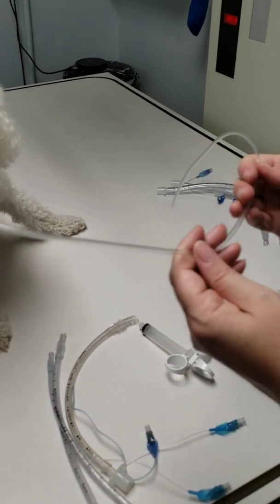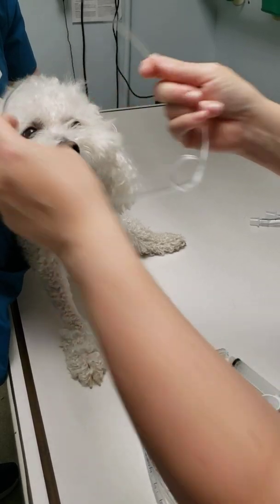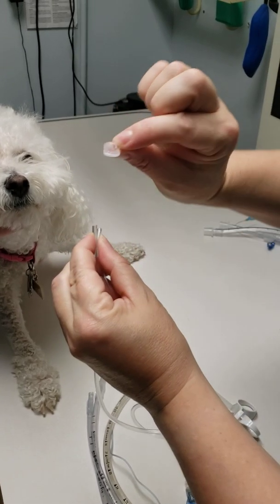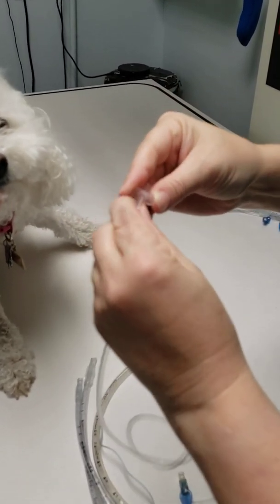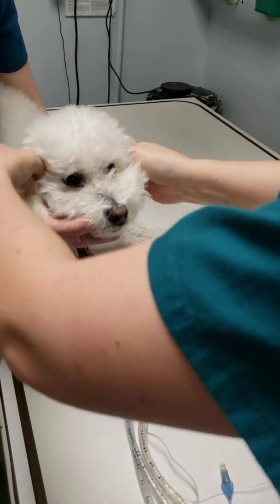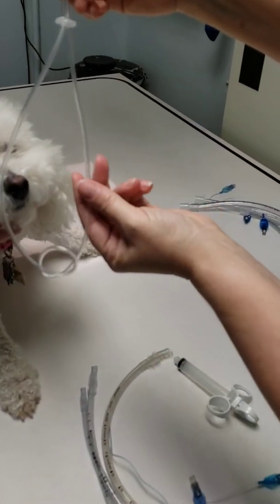When you prepare your tie, you can do one of several things. You can leave it as is — once it's inside the pet's mouth, tie it, cinch it down on the tube, and then tie it behind the dog's head. If you want to do a quick slide, put the tie in like this, line the two edges up, take the back portion of a 1 cc syringe, and slide it in. Then when you intubate your patient, slide that over the tube, cinch it down on the tube, flip this over the dog's ears, and cinch this down to secure it to the dog's head. Since there's no tube in, I'm not actually doing it at this moment, but I wanted to show you how to do a quick slide release and cinching.